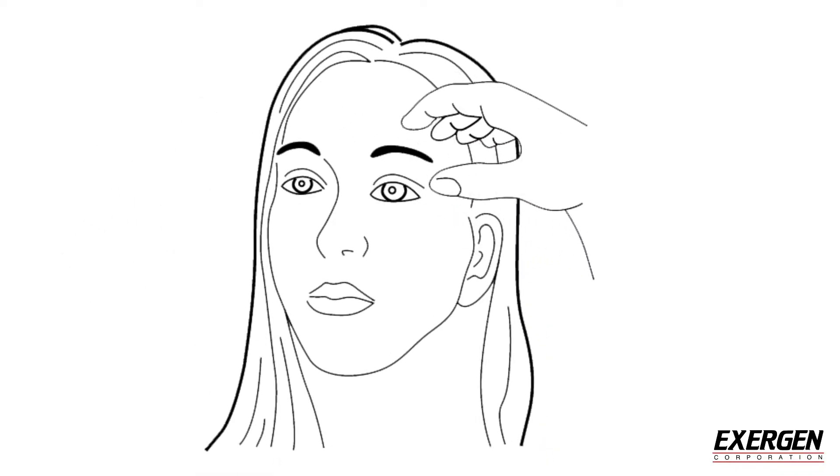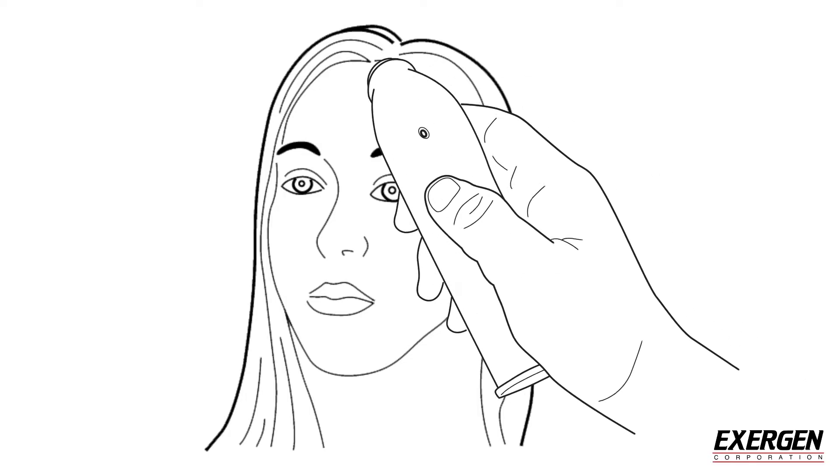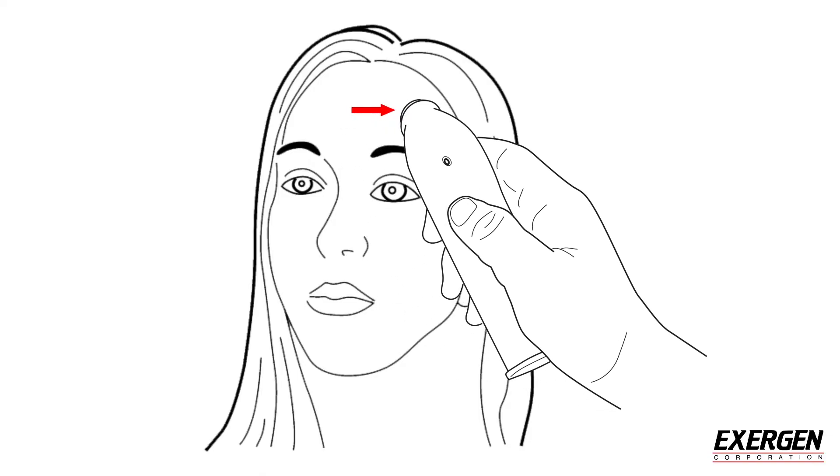Brush any hair aside if covering the temporal artery area. Place the probe flush on the center of the forehead. Press and hold the ON button throughout the measurement. Slowly slide the probe midline across the forehead to the hairline.